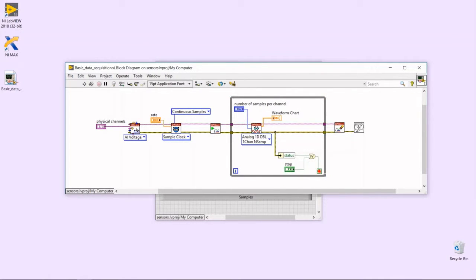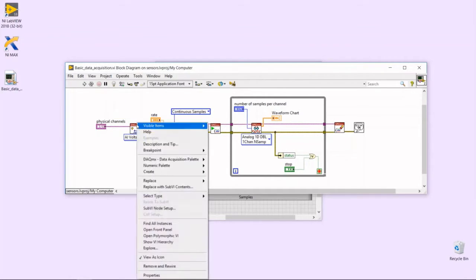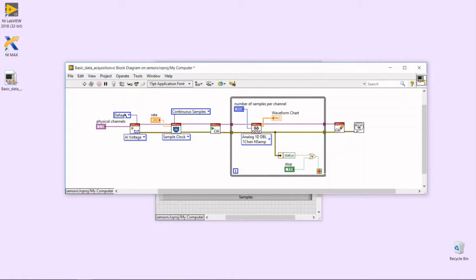So, because we're measuring from the real AD card, we have to say what the maximum value is that our input can take, what the minimum value is, and what the input terminal configuration is. Input terminal configuration specifies how we measure the signals. I'm going to place a constant here so we can see what our options are. Okay, so we have default options, which lets the program decide how to measure. So we don't want that. We want to tell the program what we are measuring.